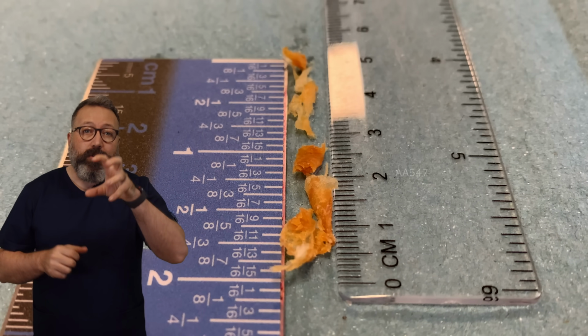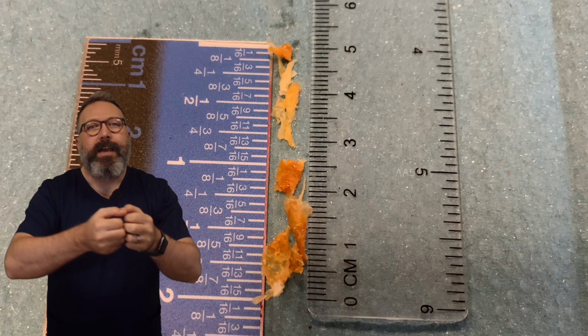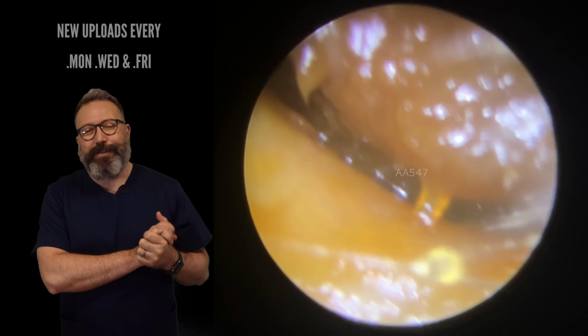So you can see all those long strips of skin. Look at the color difference, the very light skin colors, and then this really honey colored wax, which tends to be this sort of stickier type wax behind. Okay, on to our second patient, the compilation now.